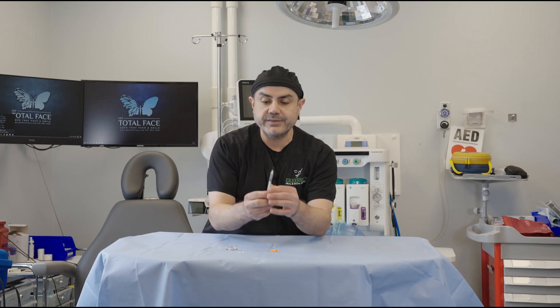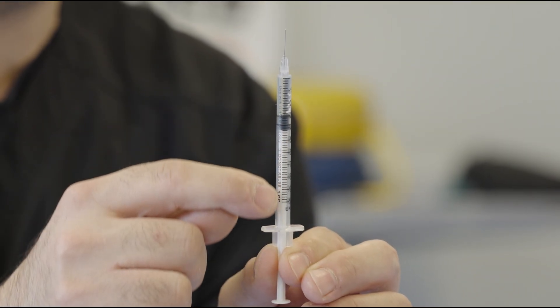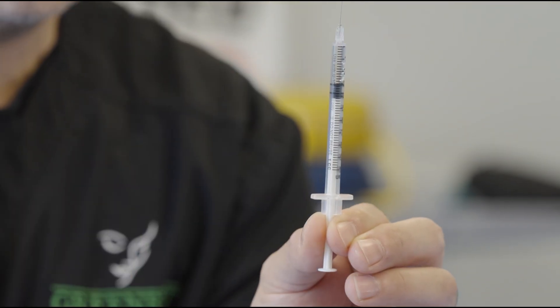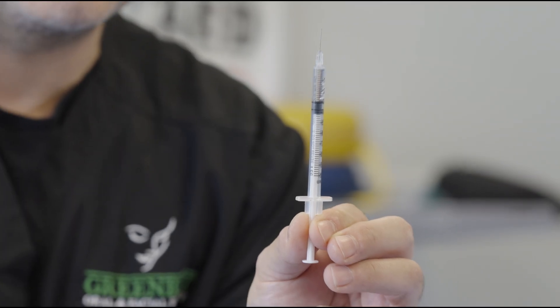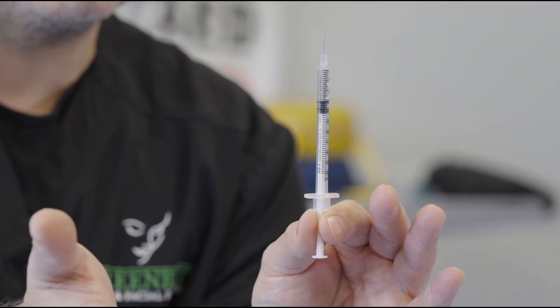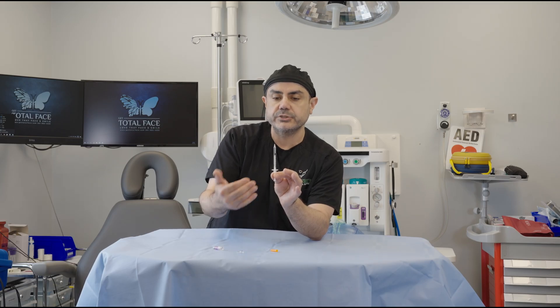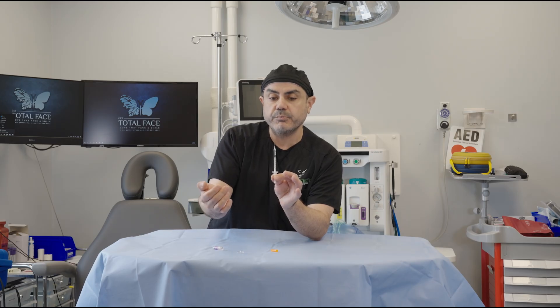Right here we have an insulin syringe. If you filled it all up, it would be one mil, which is one milligram of epinephrine. One milligram of epinephrine is what you give when you're doing CPR through the IV — not in this case. In this case, it's an allergic reaction, and the amount is going to be important depending on how you give it.